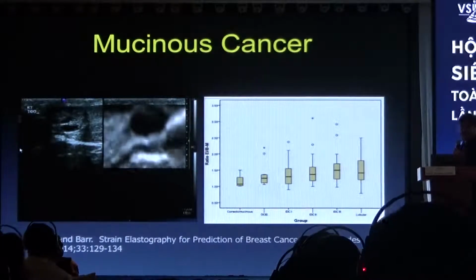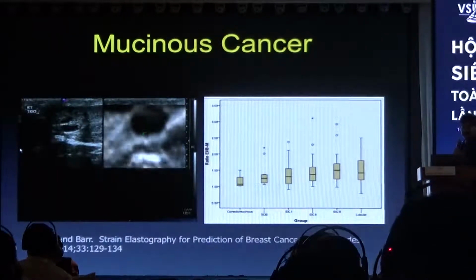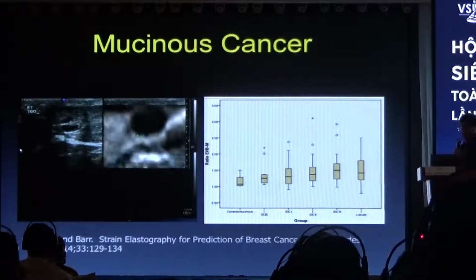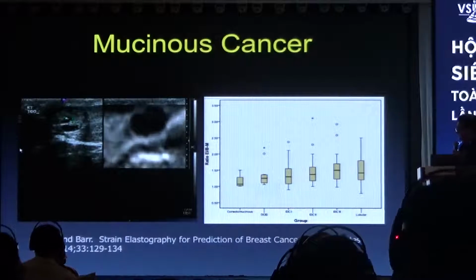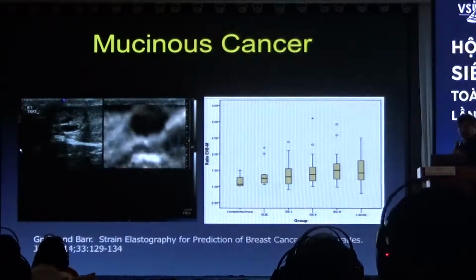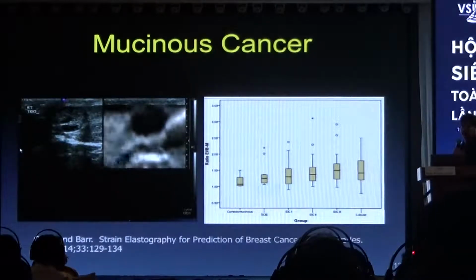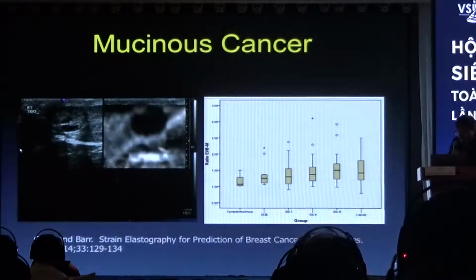And this is another factor that you should realize: sometimes we may see lesions on elastography much better than we do on B-mode imaging, because the lesion is stiffer than the surrounding tissue but has very similar acoustic properties. And the reverse is also true. If we have a lesion, like say fibroadenoma or fibrocystic change, we often see it very well when it's surrounded by glandular tissue because it's very hypoechoic and the glandular tissue is very hyperechoic. However, they have the same stiffness. So in that case, we may not see the lesion very well on elastography.